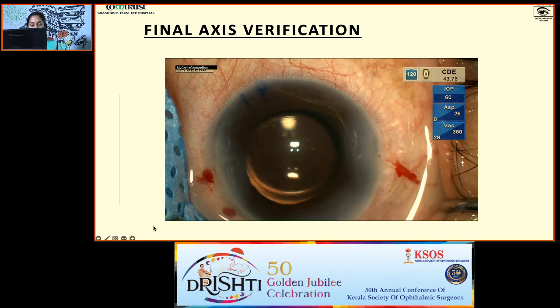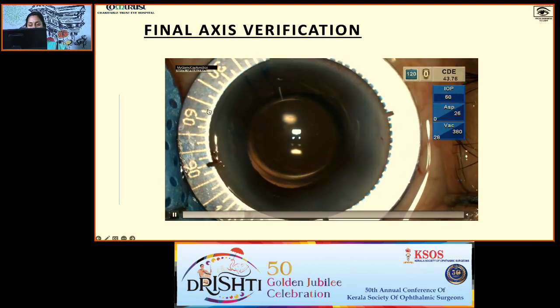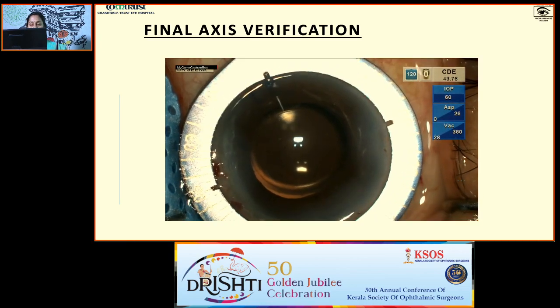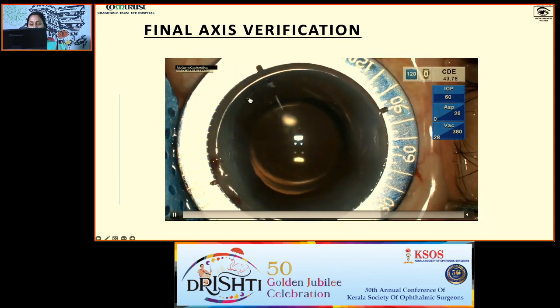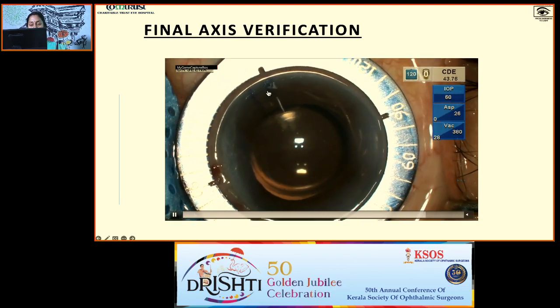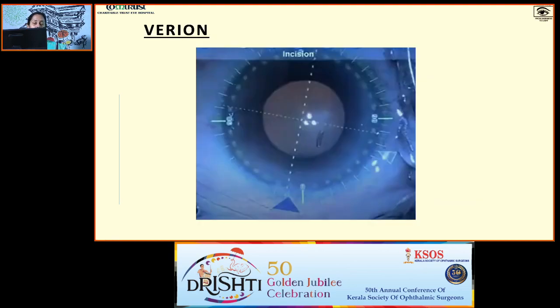Once you complete with your toric IOL surgery, just once more verify your axis is correct. Take the toric dial once more, keep it over the limbus in alignment with the 0 180 reference marking, and check the IOL toric marking is in alignment with your corneal marking, and that is in alignment with your toric dial marking. And as described earlier, the digital system also is available. It will show you that this triangle is the incision location, and the alignment axis also will be shown intraoperatively and postoperatively. You can verify with this.